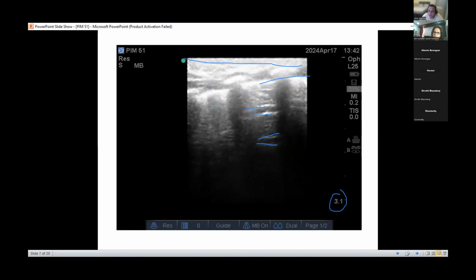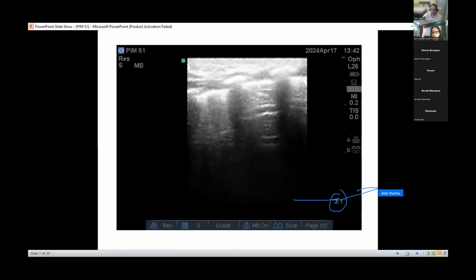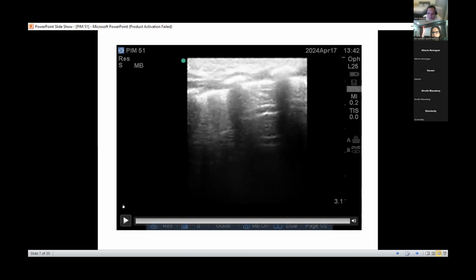Be mindful of the fact I now know the diagnosis. I think it would not be unreasonable, with what you see on this scan, to give this baby surfactant. That would be my answer. In hindsight, the beauty of it is your mental modeling convinced you this is not the only thing, that there's something else, because you can see an element of well aerated lungs. So you've done all the right things, and that is the beauty of clinical correlation that you've shown here.